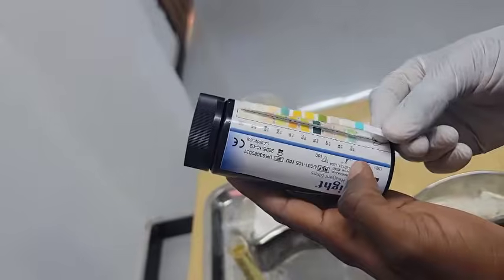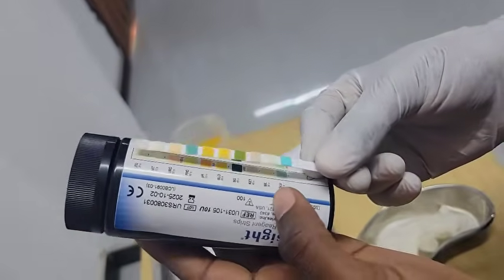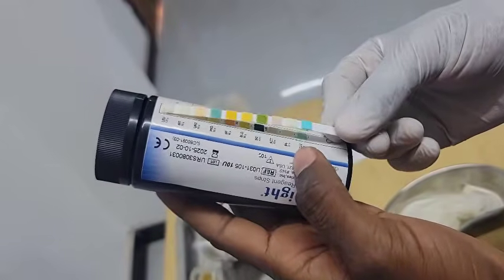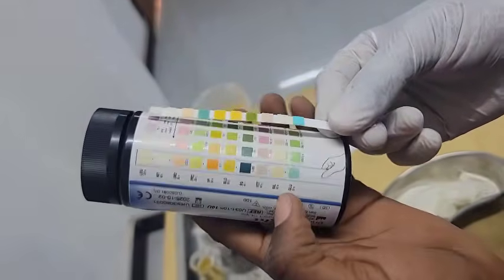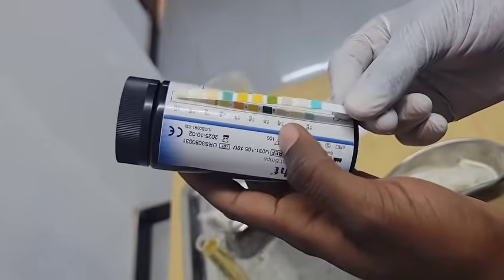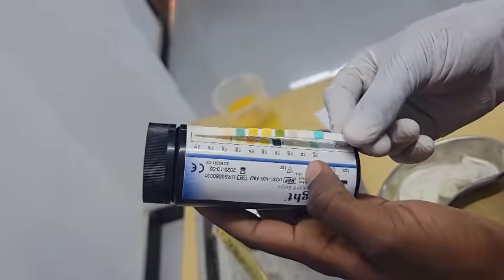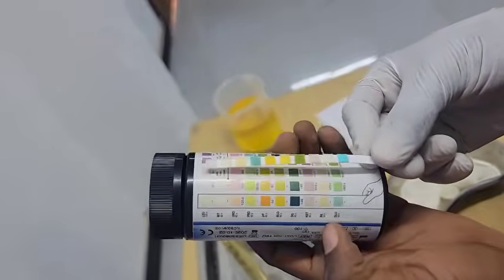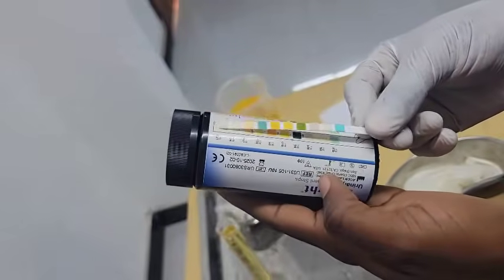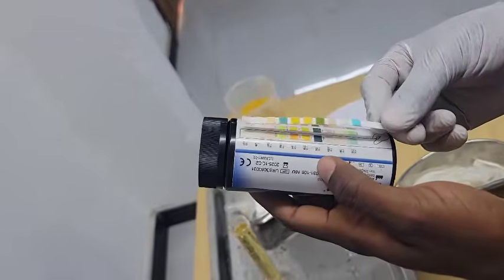It doesn't change. You move to the next chemical property. You are going to say bilirubin at 30 seconds is also negative. It doesn't change. You move to the next one, which is ketones. So ketones at 40 seconds. Ketones at 40 seconds doesn't change. So it's negative. You move to the next one, which is specific gravity.